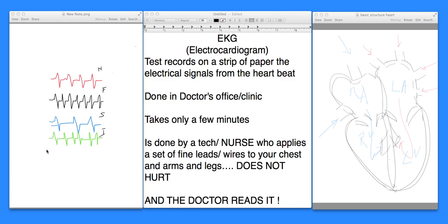So the reason I say that is also to define exactly what it sounds like. So you have a normal paced heartbeat, you have a fast paced heartbeat, you have a slow paced, very slow heart rate, and then you have an irregular heartbeat. Now each of them, they tell the doctor different information, but the fact is that only an EKG can help tell us what's going on as far as your electrical beats or electrical complexes or your heart pace is concerned.